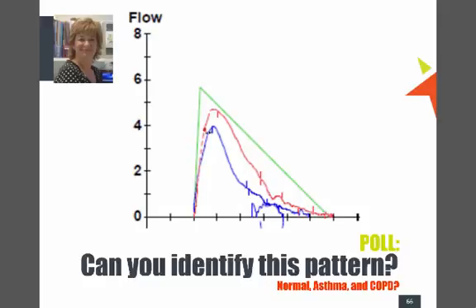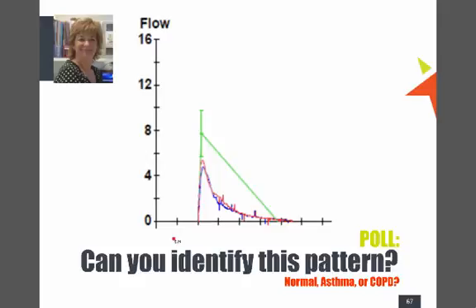So we've got the flow going out the first time and the flow the second time. It'd be ideal if that second one was right up there. We can see quite a significant difference there. What's that telling us? Yeah, everyone's writing. Brilliant. Yep, unanimous. Absolutely brilliant.